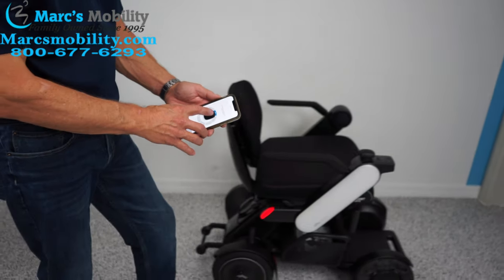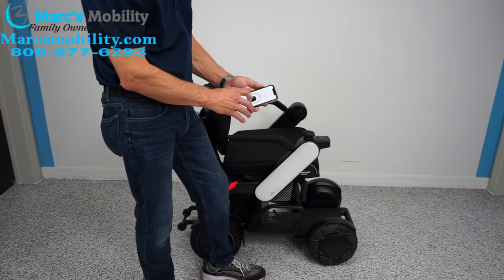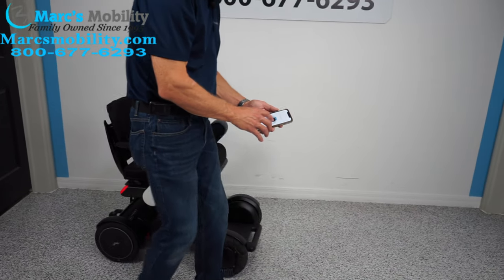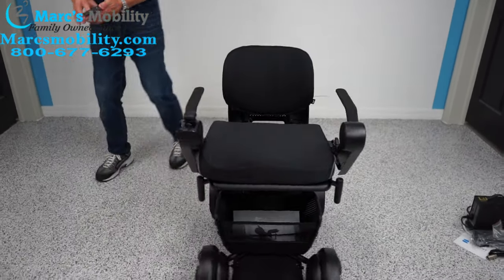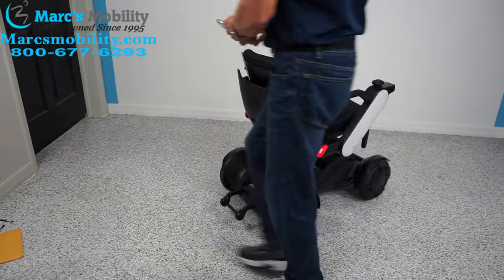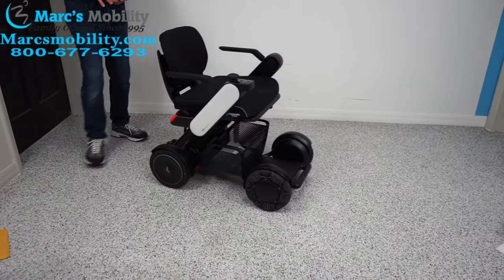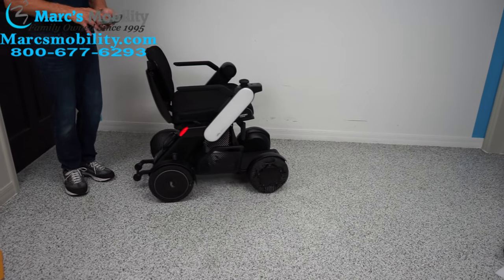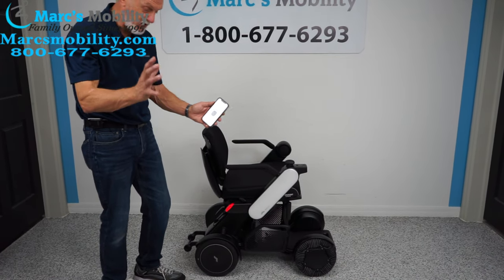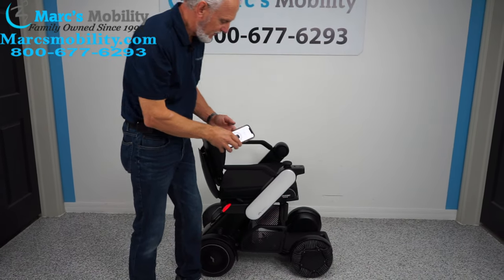If I move this forward, you can see I can drive the chair — and I can reverse it. If you're walking with someone you can do just this. Look how easy that is — just fantastic. It responds exactly. This is the first time I've done this and I'm telling you, it was very easy.